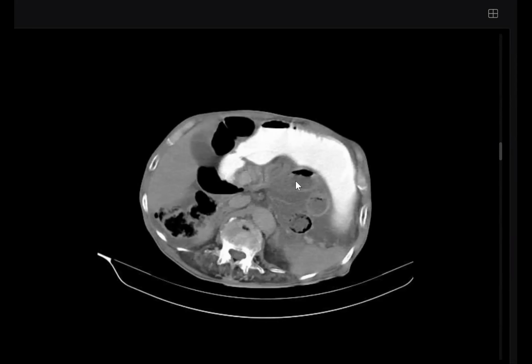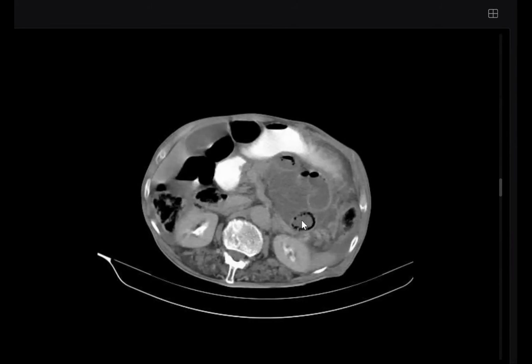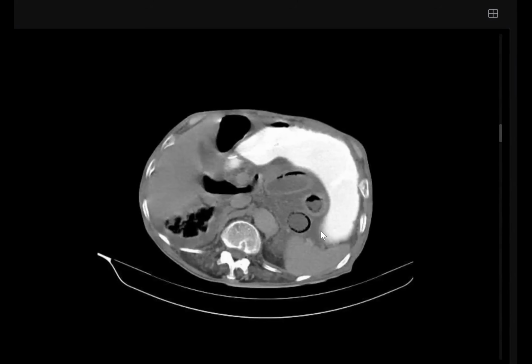It's not essential to determine the type of hernia in the exam. But the complications, you passed this case. Since you diagnosed it as ischemia, you passed this case. Okay? But some clues are important to reach the full mark. Okay, thank you, my friend.